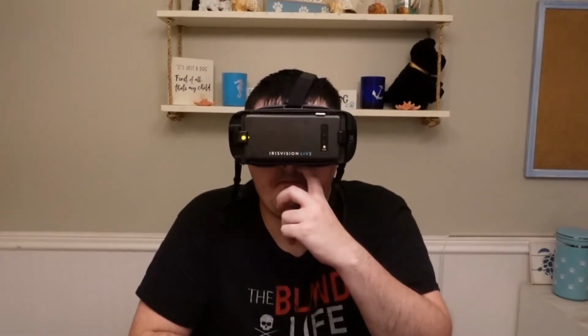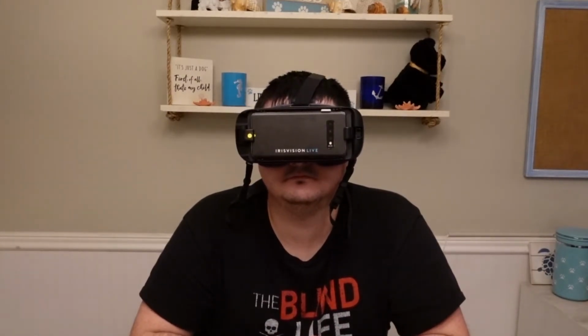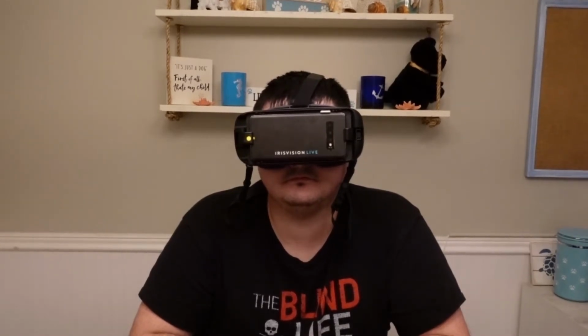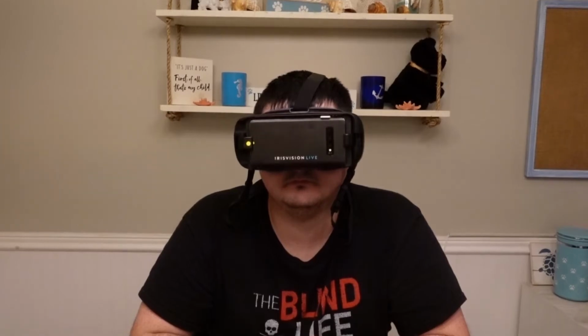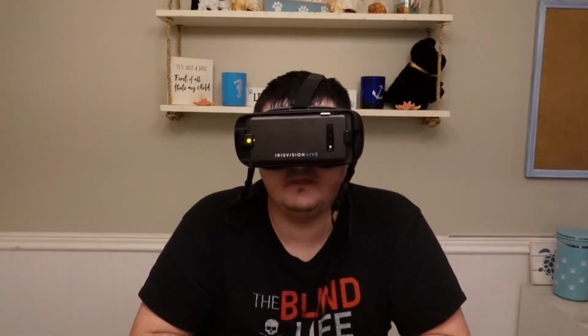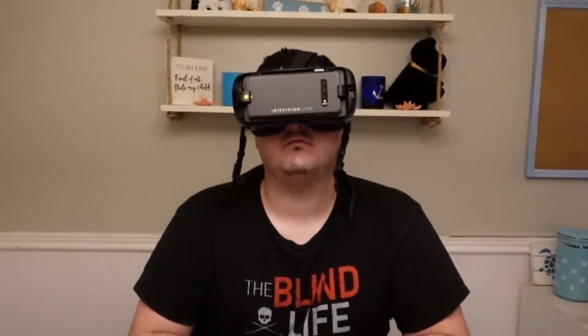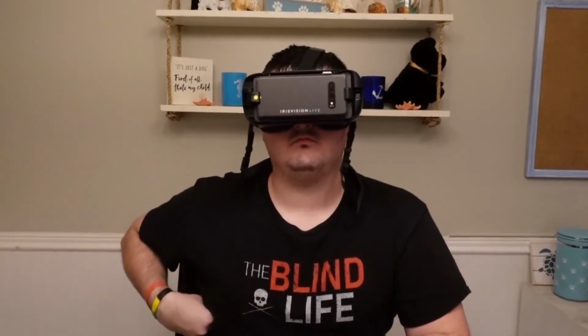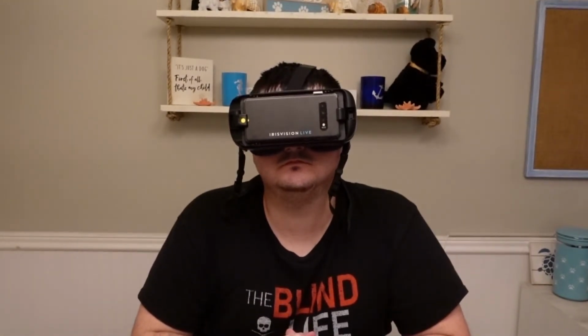In photo gallery mode, select a photo by swiping on the touchpad. Of course, we don't have any photos to demonstrate this, but the selected photo will be highlighted in a yellow border, so a rectangle with a yellow border around it. You can also use the voice commands next photo or previous photo to navigate through the photos. Open the highlighted photo by tapping the touchpad once.